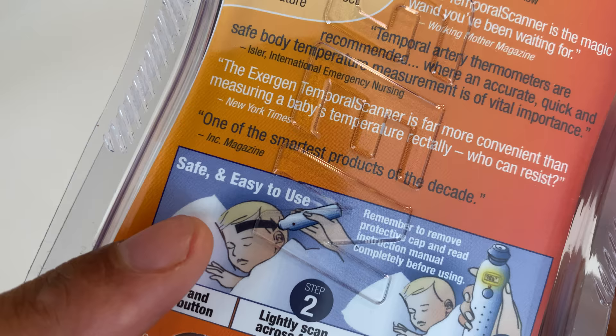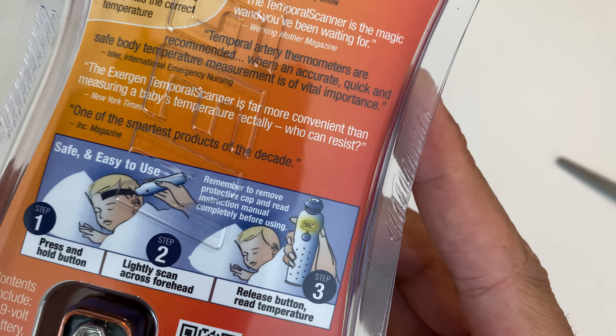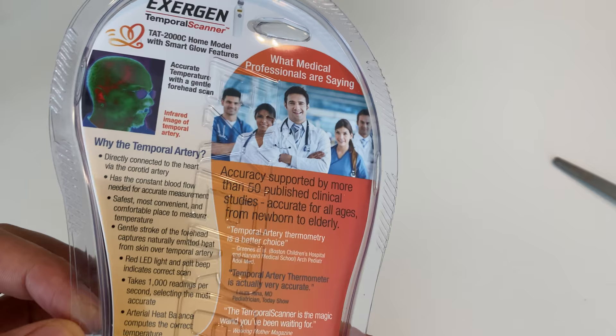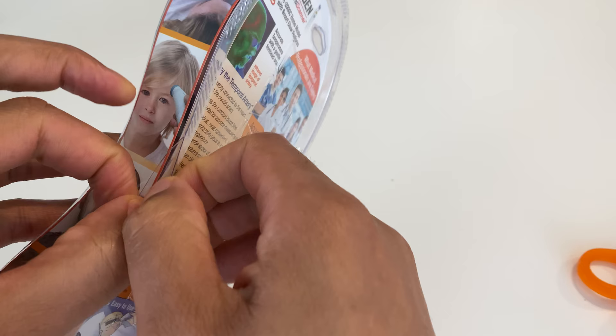There's a battery included. It says safe and easy to use — one press, hold the button lightly, scan across the forehead, release the button, and read the temperature. There's also a note saying remember to remove the protective cap and read the instruction manual completely before using. There's a lot more material on the back — I'll save that for the restroom later.